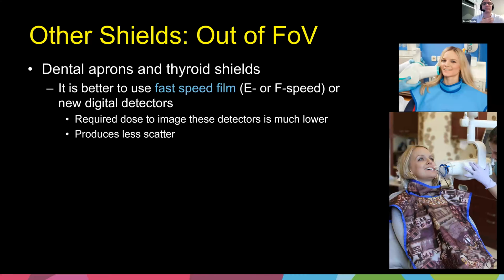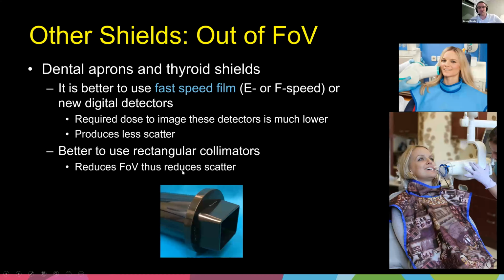And so you can place a thyroid shield over the patient, but once again, it's just dose coming down from the scatter. So the thyroid shield is not preventing anything, because thyroid shields only prevent radiation that's hitting it from the outside. It's not preventing anything from coming down into the body. And so you will save more dose to the thyroid by using new technology and collimation.